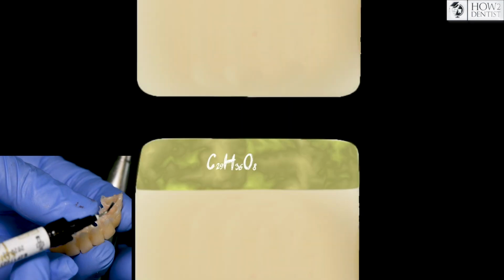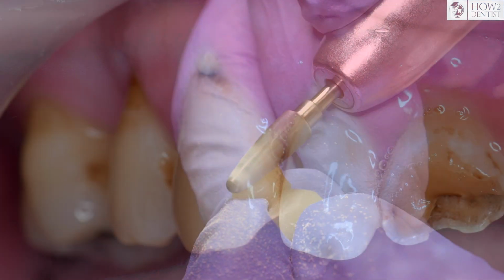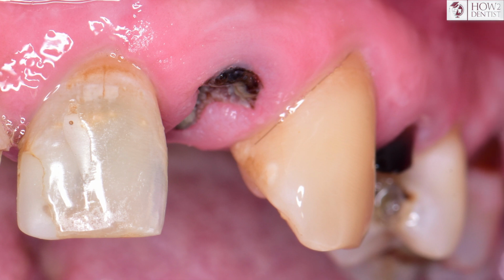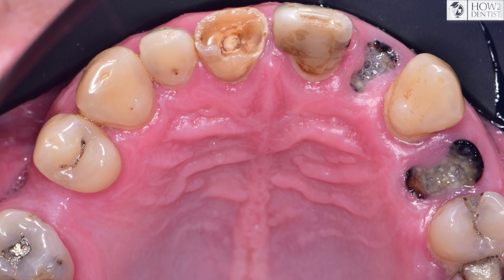Hi, today we continue to talk about temporary crowns, and in this episode we will tell you how to make a temporary crown in a case that can occur quite often. The patient had a rest or was simply not attentive to dental health. As you can see in the photo, you need to do something in order to temporarily rehabilitate the patient aesthetically.